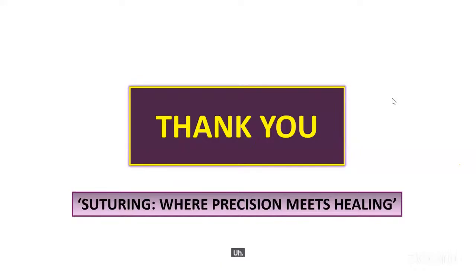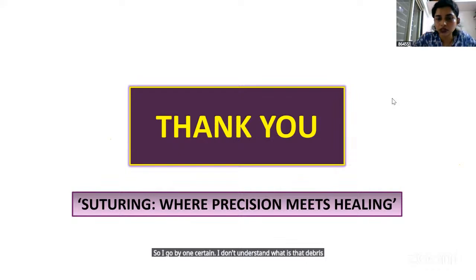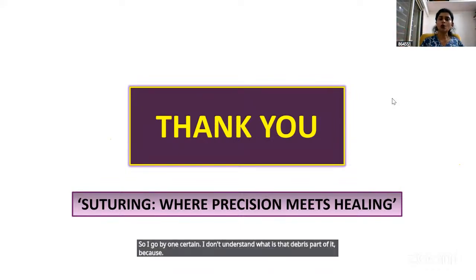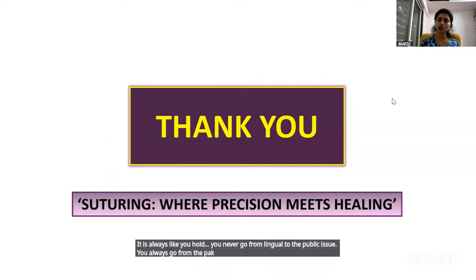I didn't understand what the debris part of it is, because you never go from the lingual to the buccal tissue. You always go from the buccal to the lingual tissue, and then you pull the suture and tie a knot on the buccal side.